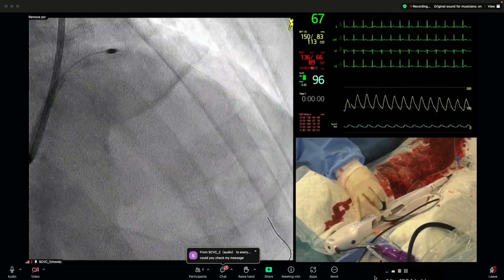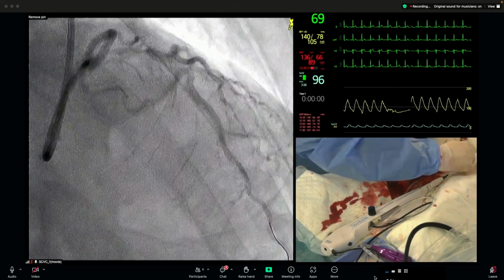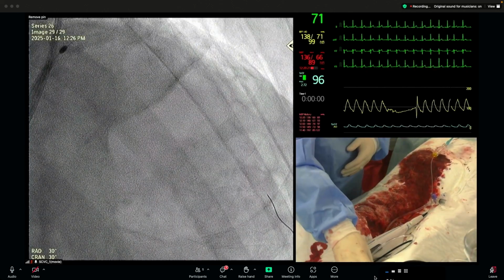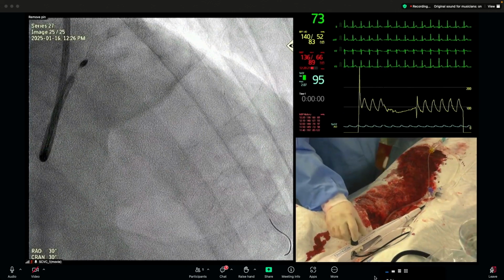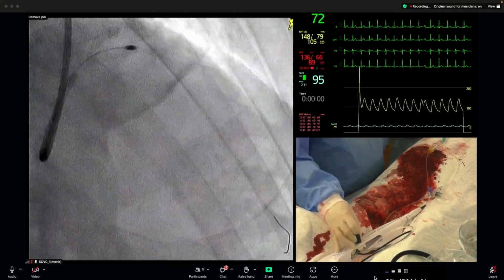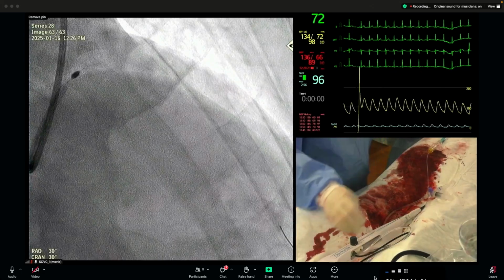The second question I would like to ask Dr. Kojima concerns the luminal gain. I think the orbital atherectomy device is also available in Japan. With the use of OAS, you can create a much bigger luminal gain in diameter, using a slow speed followed by high speed. What's the choice of rotablator as compared to OAS in this particular case? Thank you.